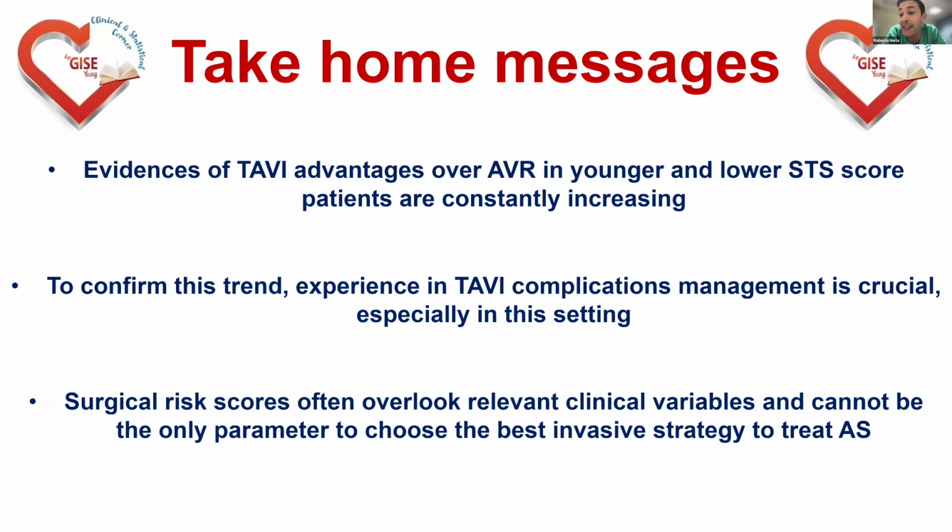To confirm this trend, it's very important that we keep on going how we are doing. So reducing complications in general, including vascular complications, risk of paravalvular leak, risk of permanent pacemaker. These are important in general, but in particular for this very young population.